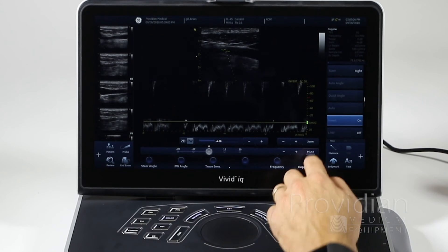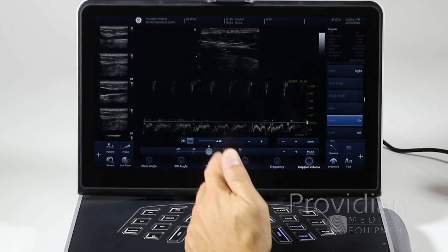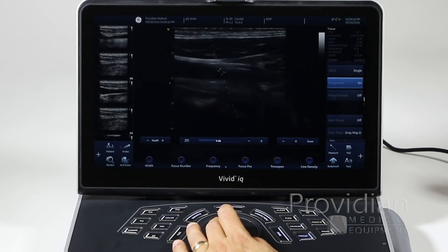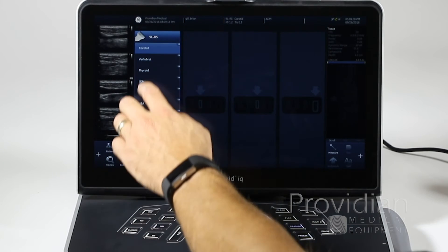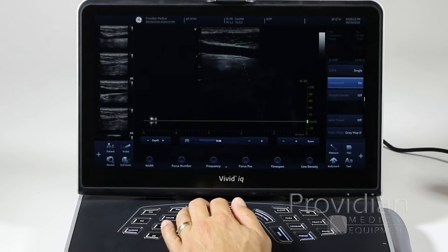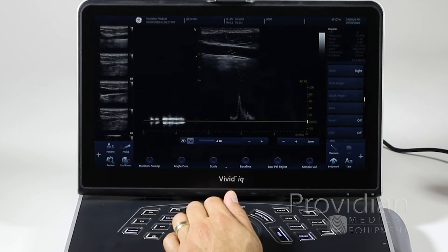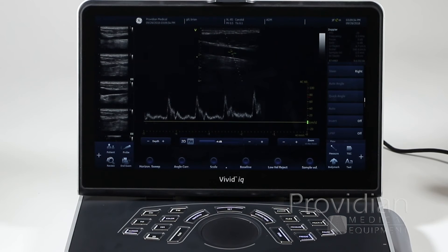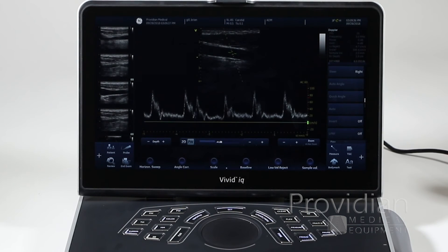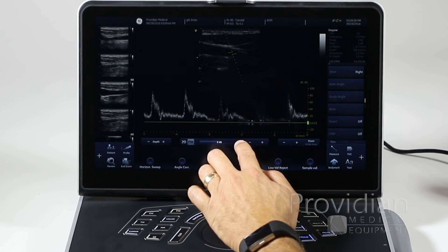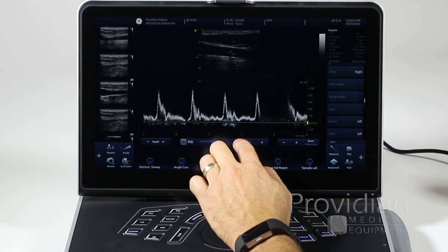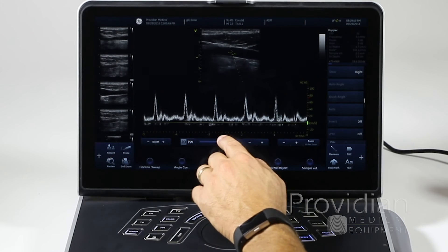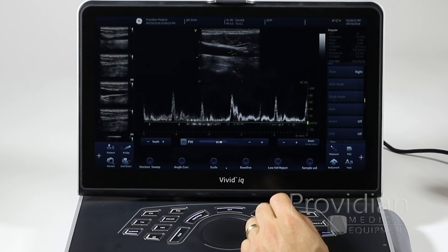There's a handy mute button right there as well. I've made a mess of this image, so I'm going to get out of that — PW again, going back. I'm going to reselect my probe to go back to the default image. If I want duplex imaging, I'm going to hit the pause button. And if I want to adjust the gain, I've got my pulse wave Doppler gain there, but I can press 2D and that's going to adjust the gain on my 2D image. You can change the active mode gain by dragging or using those plus/minus signs.